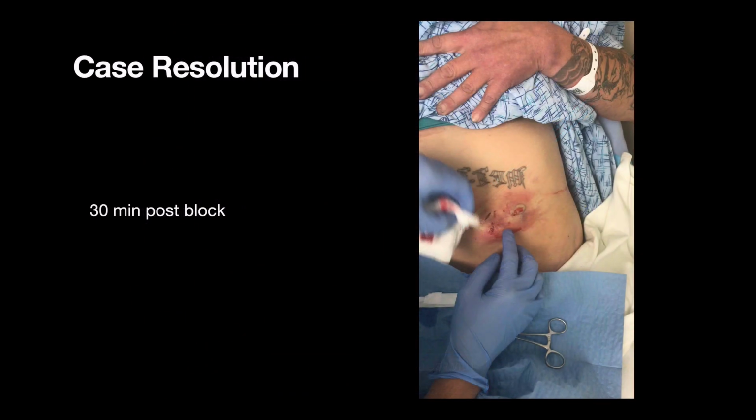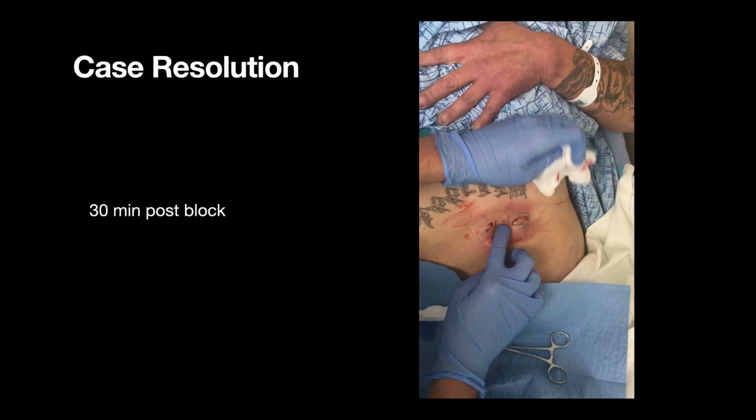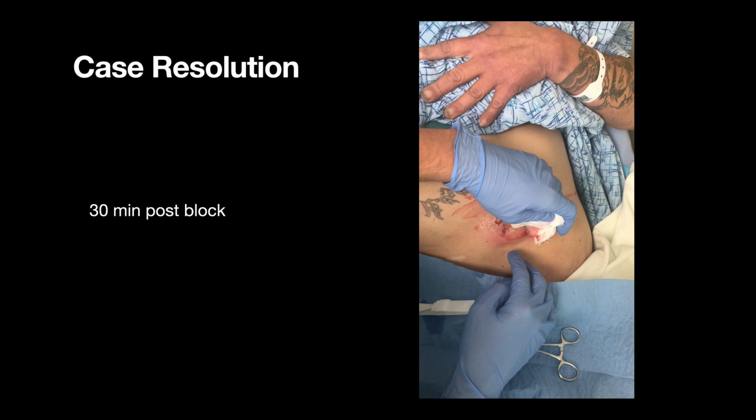We blocked her, walked away, saw some other patients. And this is a short clip, but you can see that we're able to express fluid out of her abdomen. She got that completely opened up, a wick drain, and was discharged, comfortable. I started her on PO antibiotics and pain medication, which was great because she got to leave and not have procedural sedation. Your case?